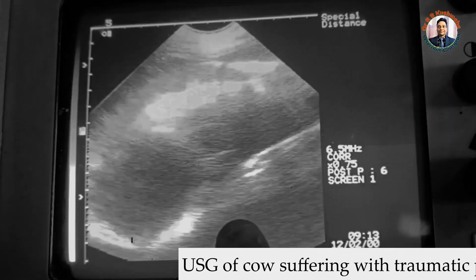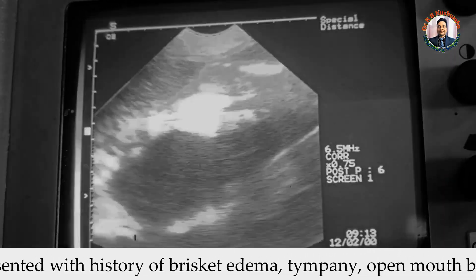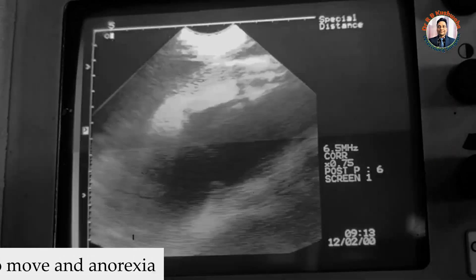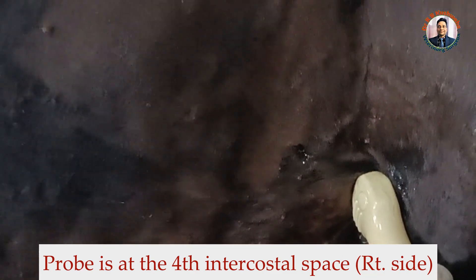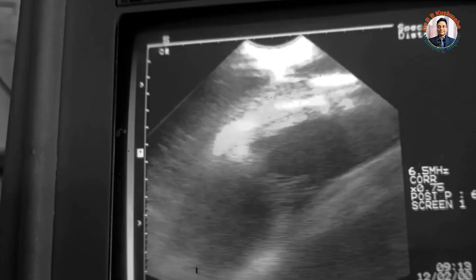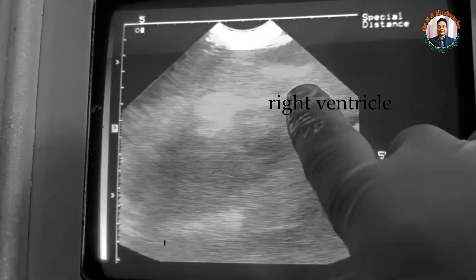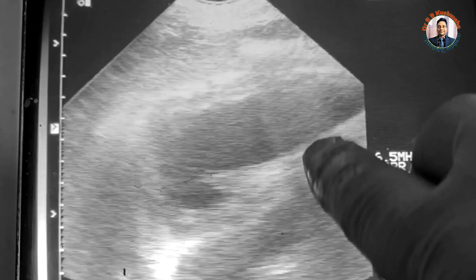This is the ultrasonographic picture of this cow. Right now the probe is at the fourth intercostal space. You can see here the right ventricle, the left ventricle, and the interventricular septum. And this is the fluid you can find here.